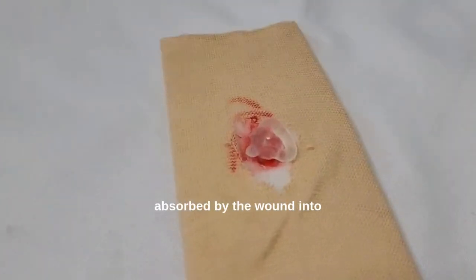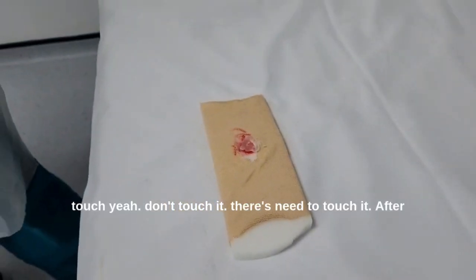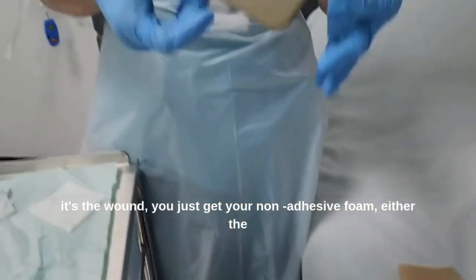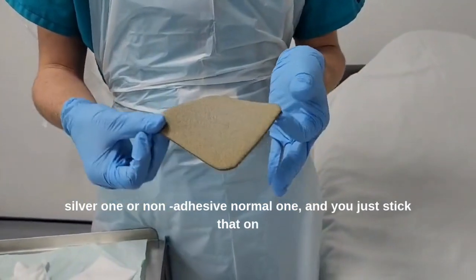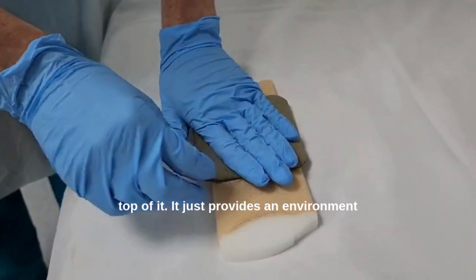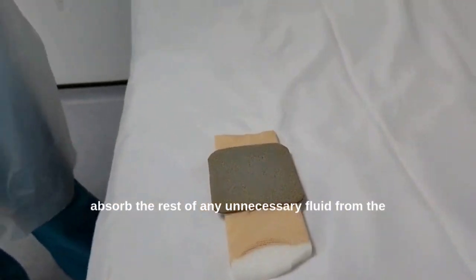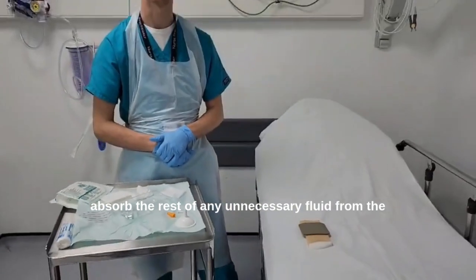It fills up and will be fully absorbed by the wound. Don't touch it — there's no need to touch it after it's in the wound. You just get your non-adherent foam pad, either the silver one or the normal one, and you just place that on top. It provides an environment for the wound and the pad will absorb any unnecessary fluid from the wound.